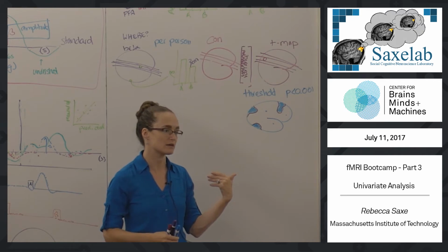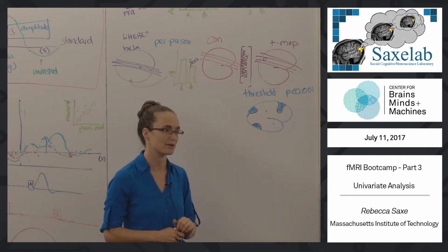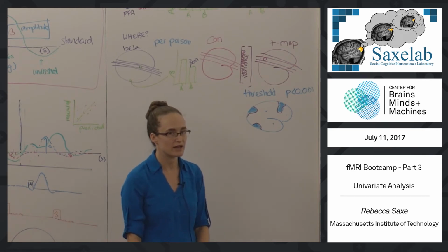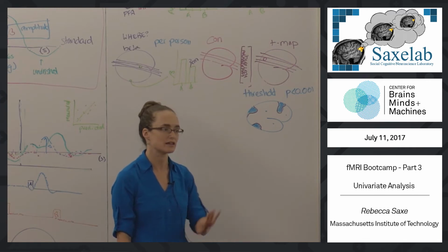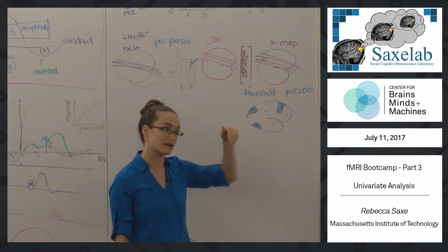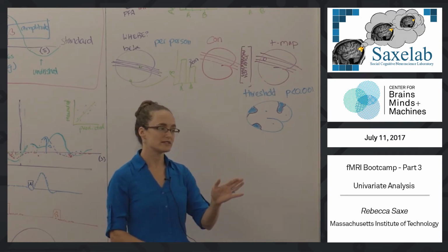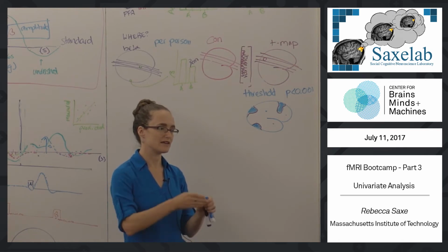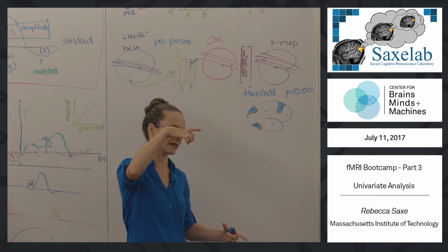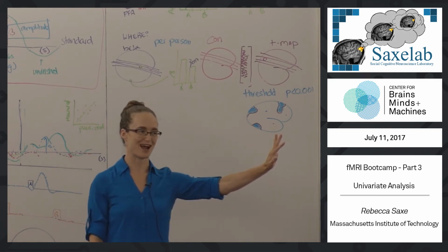As I said, we do that with cerebellum. We look for where the cortex is, we cover this cortex, never mind the cerebellum. So that's based on anatomy. But it's pretty unusual, and I can't think of a normal situation, only an extreme situation, where you do functional analysis and then figure it out. And as a very brief aside, one reason for that is ghosting. If the edge of your slices is inside the brain, not outside the brain, you get wraparound and all kinds of craziness. Anyway, that's a separate topic for acquisition.